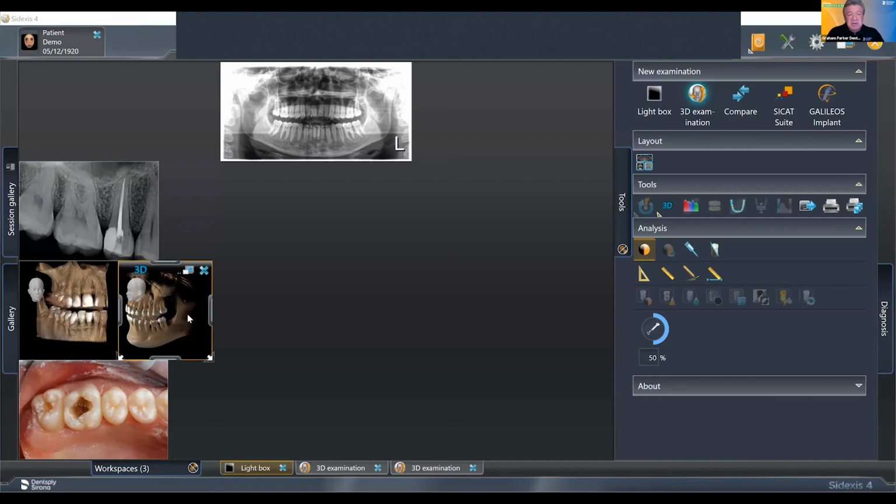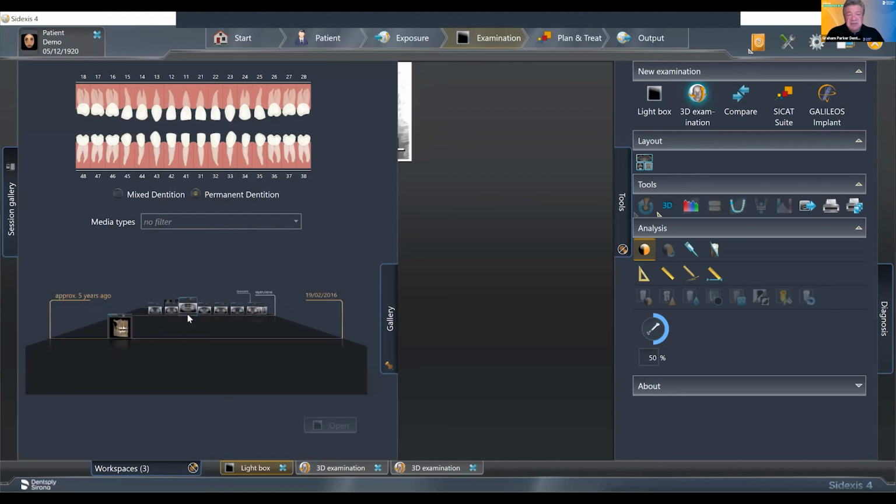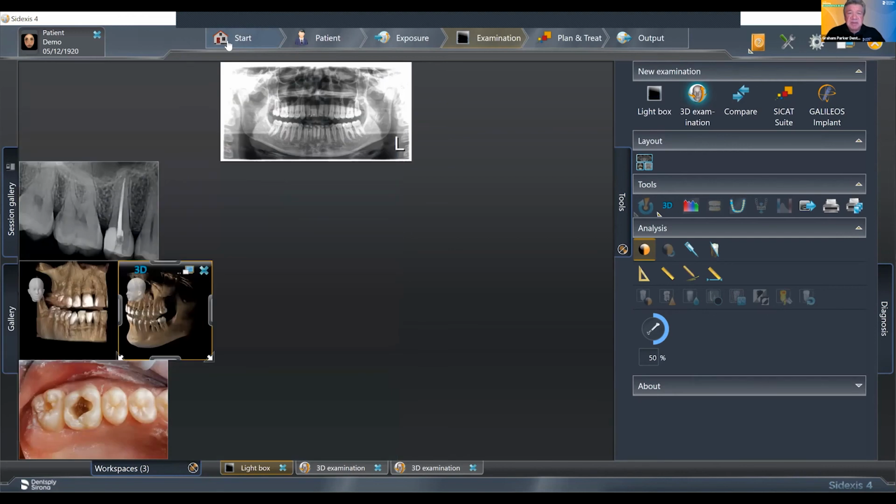Yeah, so it's my little Rolodex system here for pulling up images. They're all done in date format, so past and present images can be pulled up at your leisure. Back with us. Oh, yeah, can you hear me, guys?